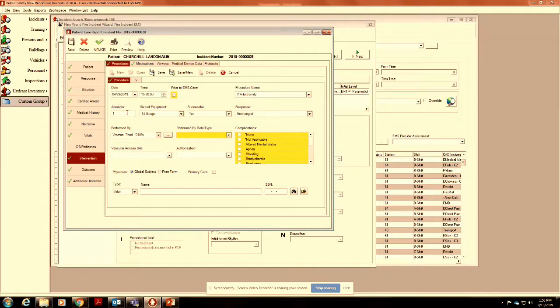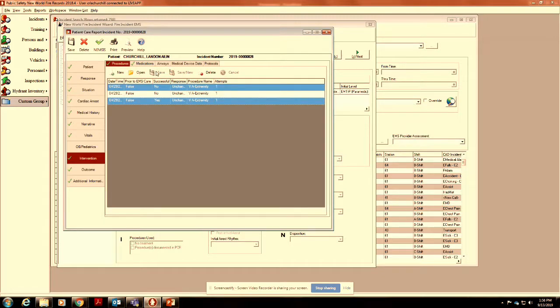Luckily, we have Chief Roman to help us out with these types of things. And he somehow managed to get it in the right hand. Amazing. So that's what that should look like. You can see no, no, and yes.